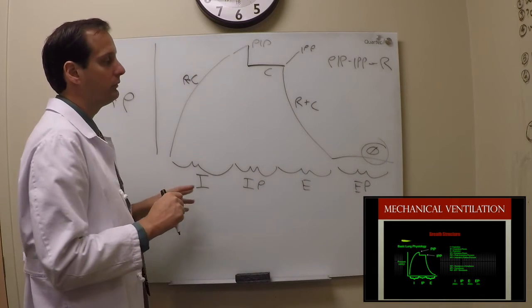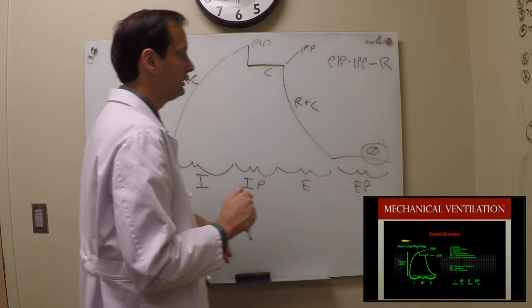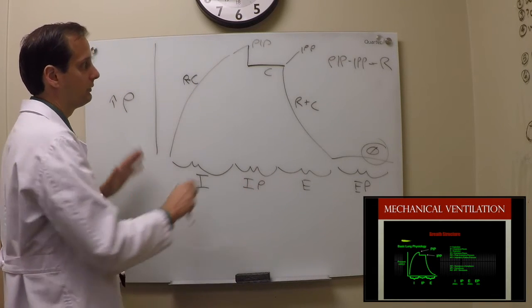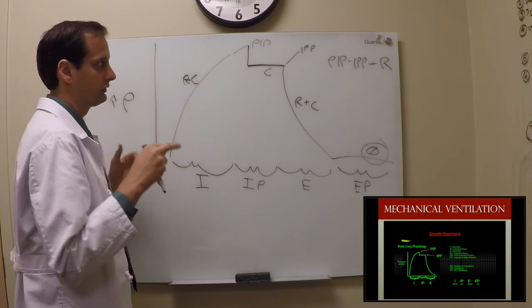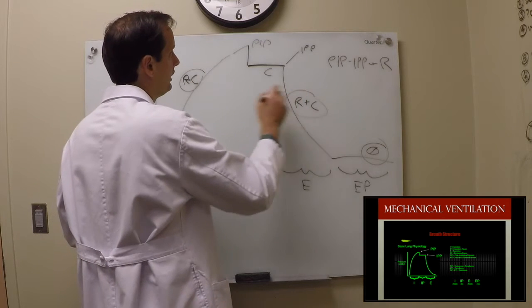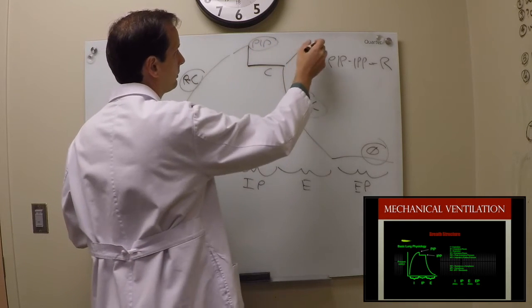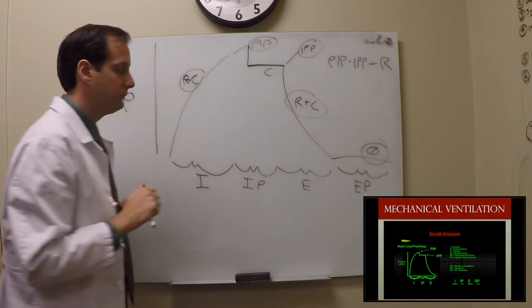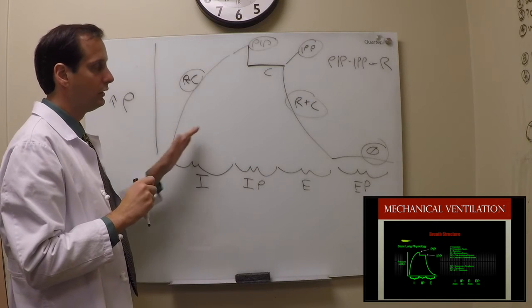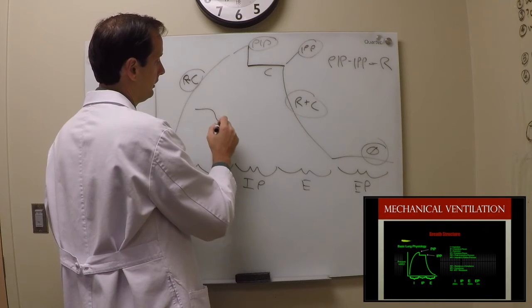And this is why when we measure our hemodynamic measurements, we do so at end expiration. It's because we don't want our numbers polluted by the pressures associated with our pulmonary pressures from our thoracic cavity. We don't want to see this resistance and this compliance affected, and the result of our inspiratory plateau pressure and our peak inspiratory pressure showing up on our hemodynamics. And when you look at your hemodynamic tracing, you'll notice that the overall trend goes up, down, up, down, up, down.